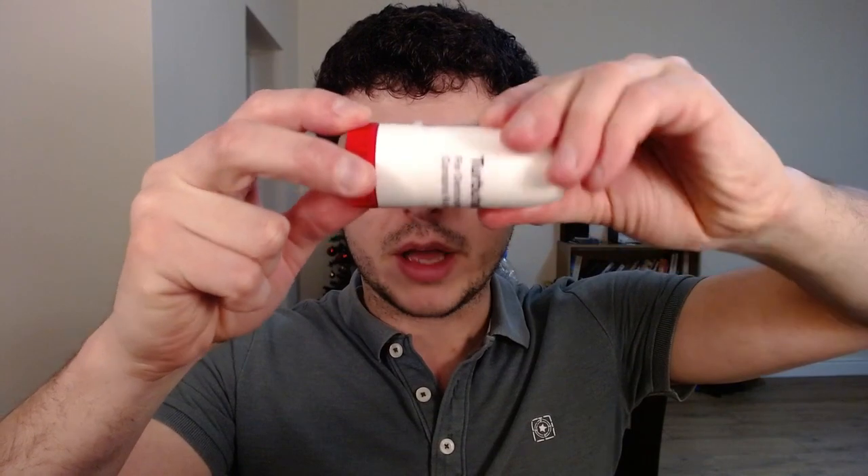How do you use this thing? Basically, if you hold it like this, hold the red bottom, grab onto the top and just twist it off. And there we go — you can see the inhaler here.